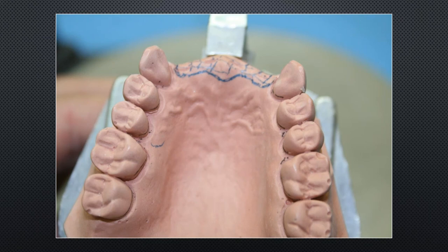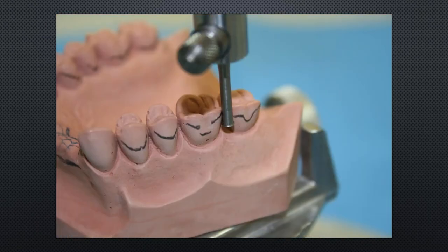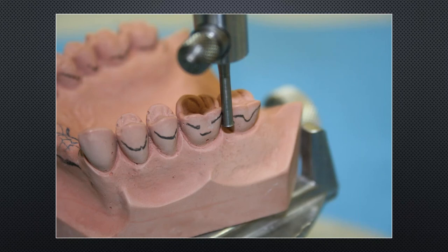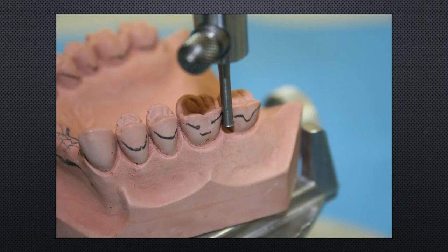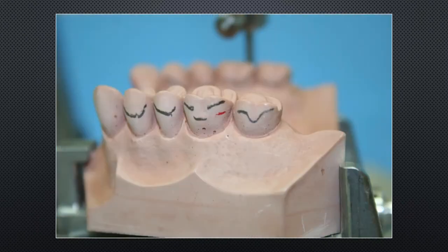Step one is to outline the edentulous area. Then, using the 0.25mm undercut gauge — which every surveyor comes with and covers 90% of chromium cobalt clasp situations — mark the terminal end of the retentive clasp. For example, on the distal buccal of tooth 1.6 (tooth #3 in universal numbering), a 0.25mm undercut is marked with a red pencil.